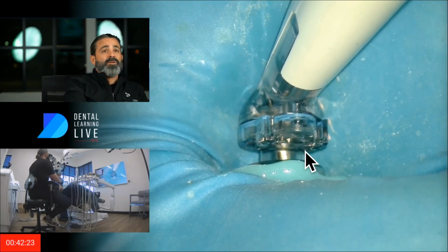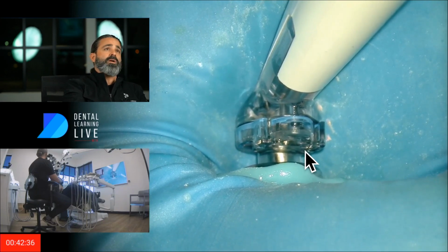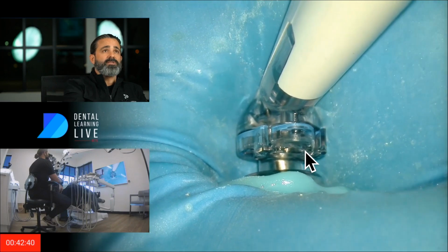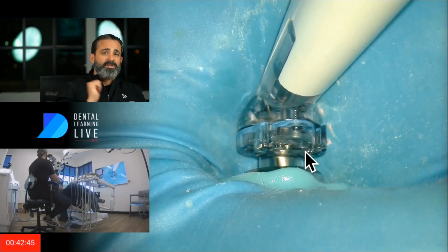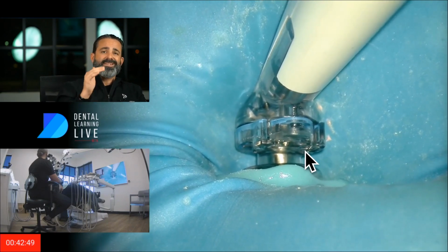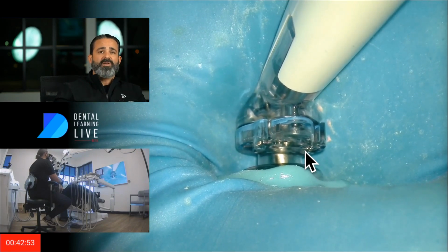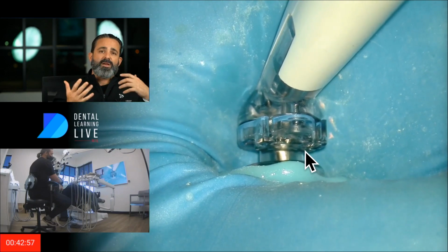Okay, well, we're going to run through the cycle of hypochlorite, then water, then EDTA, and then water. And you guys likely know the time. The console does the magic, degasses the fluids, puts it through the procedural instrument, adds the fluids to the tooth, degasses it, cavitation occurs, creates the mechanism of action, a cavitation cloud. Those bubbles expand and contract, creating sound waves.